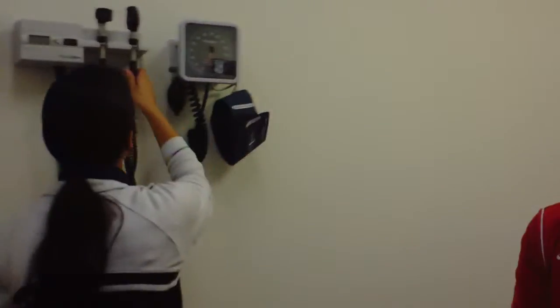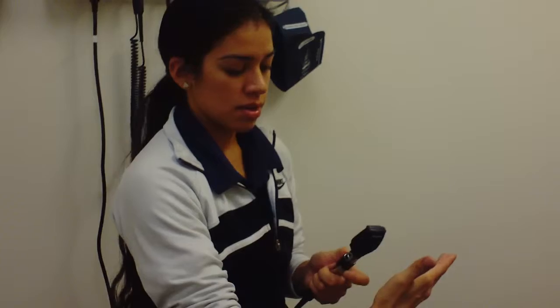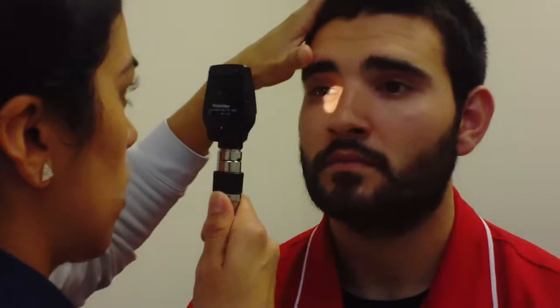I'm going to pretend that I'm going to be examining his right eye, so that I would hold the ophthalmoscope with my right hand, put this hand over his forehead and my thumb over the eyebrow, and then look in closely like that. Okay, so now we're actually going to start the exam, and we're going to be examining Jimmy's cornea first with a short focal length. Okay, I'm going to set it to my short focal length number, which is number 3. Okay, and just go ahead and look straight ahead.